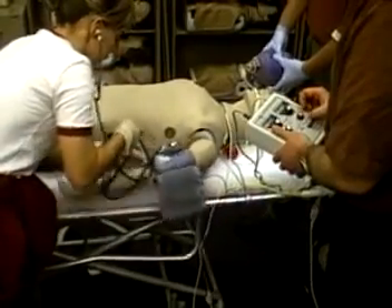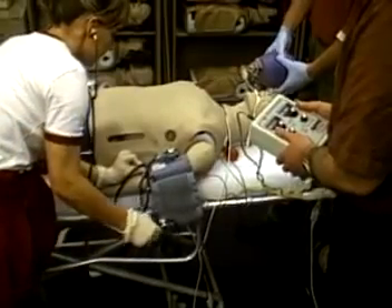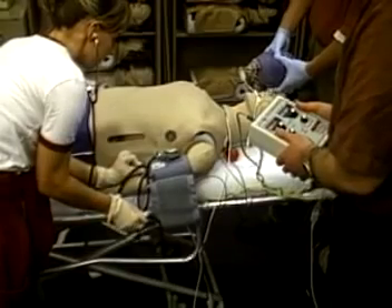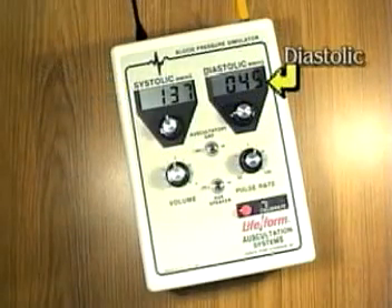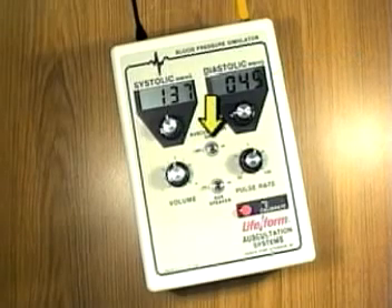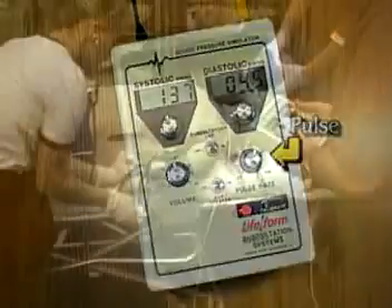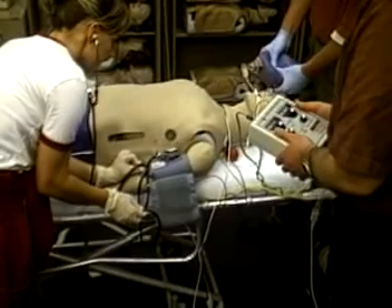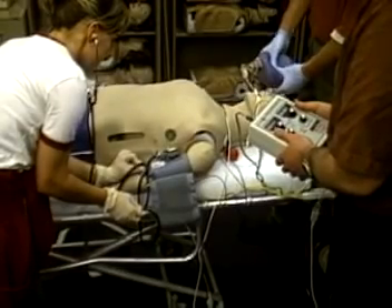The blood pressure simulator allows the instructor to set and alter the mannequin's blood pressure in response to students' actions. You can set the values for both systolic and diastolic pressures. The Korotkoff phases can be turned on and off with a switch, and volume and pulse rate are also adjustable. The student monitors the readings through a speaker in the arm. An optional external speaker is available, allowing sounds to be heard during group presentations.